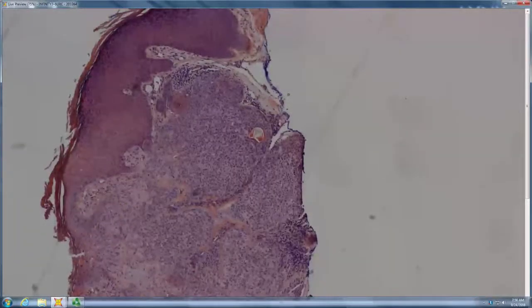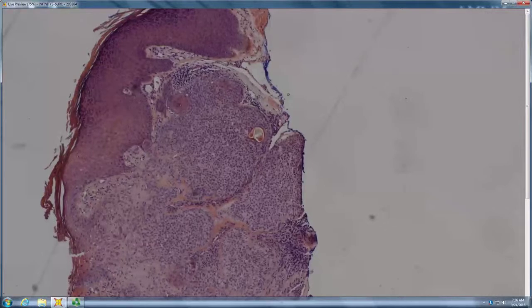So all this, the palisades, I would say trichoblastoma. They are clear, they palisade, they have a thick red basal membrane zone, so you are correct, trichoblastoma. Well done. Someone needs to pass that easy button.